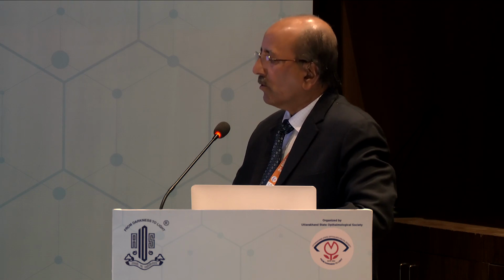So, do you have an age cutoff when you will implant an IOL after pediatric cataract surgery? Yeah, definitely. First we have to find out which cases are fit for implantation of an IOL. Ideally, it is 6 months or so. Less than 6 months one may not do, or one has to be very careful.